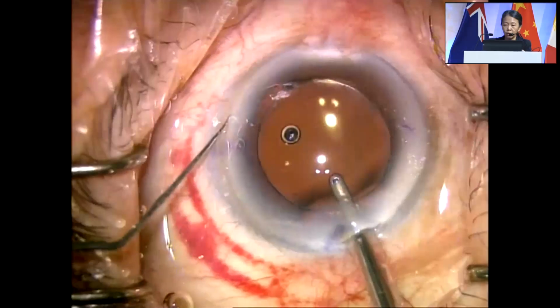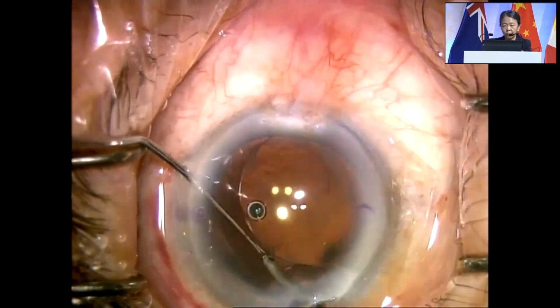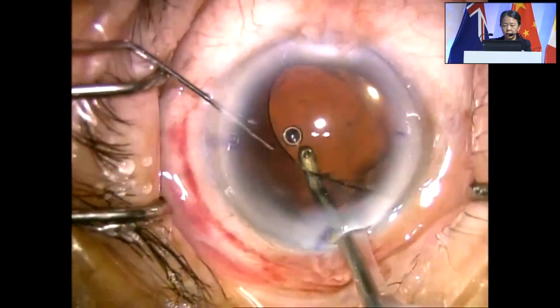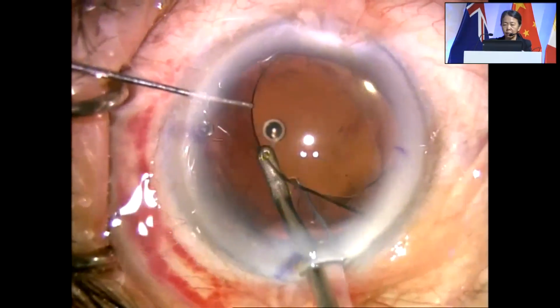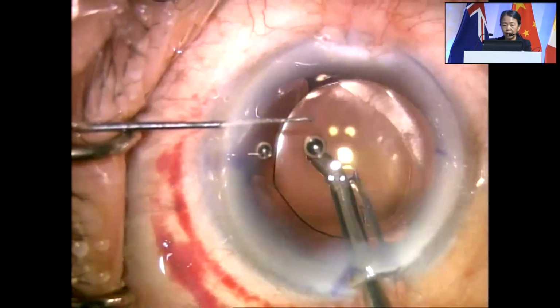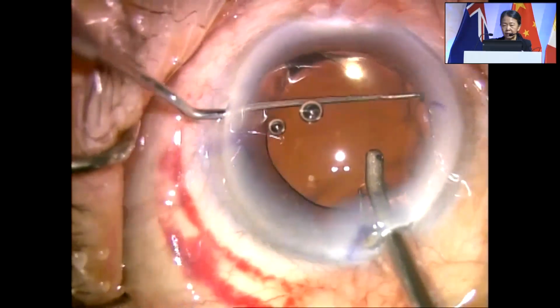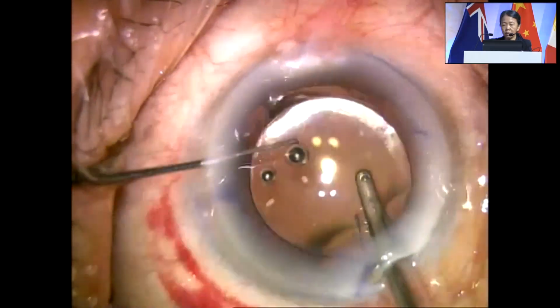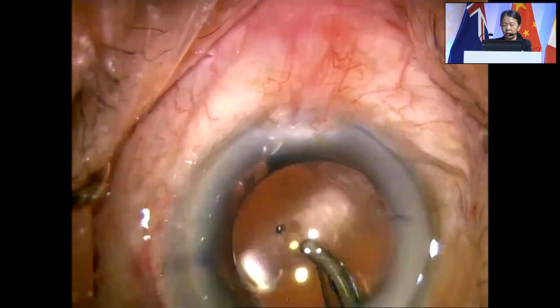I think this is controversial. I had adequate follow-up of this patient, and that lens, fortunately, has not rotated. I do think it does depend on your haptic design, but I have used the Alcon platform for many years in my practice, and I did not see any movement even with any capsule change.